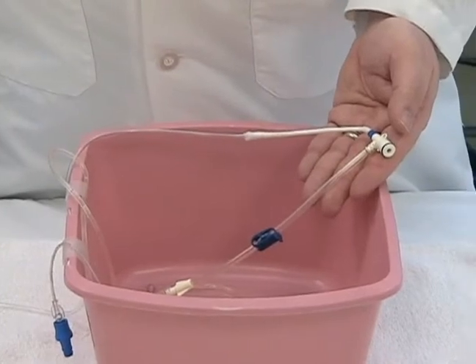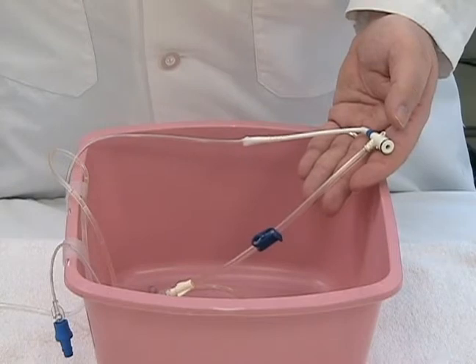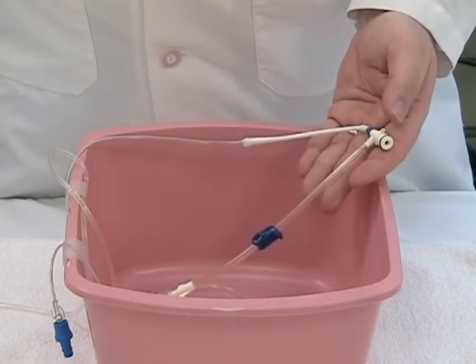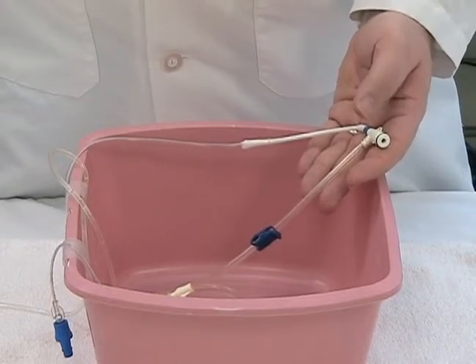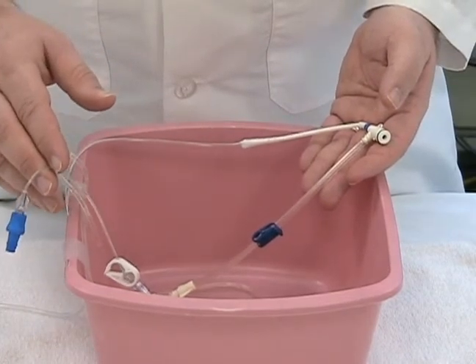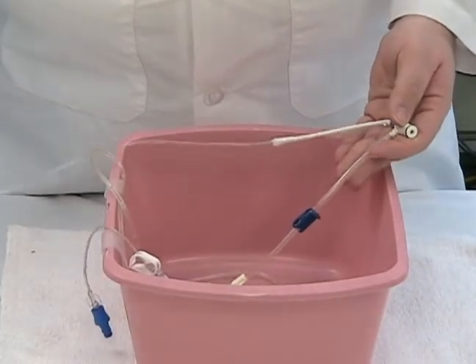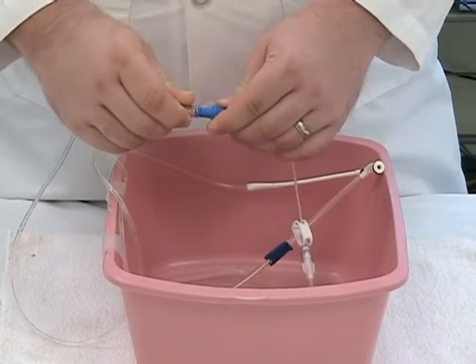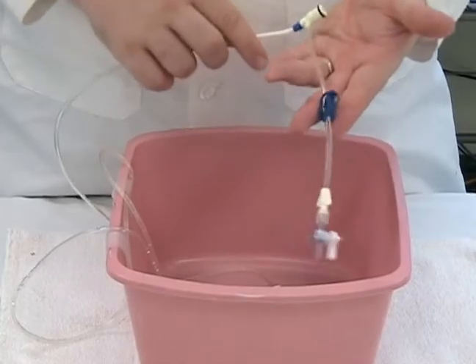This is a cordis line adapter which will attach to your IV fluids drain. Our CTICU nurses asked us to give a simulation of having a central line in the neck of the mannequin that they could push medications and fluids through. We created this adapter, and then it attaches to the extension set, allowing a full circuit that you can push through the neck of the mannequin and have it drain into the basin below. Once the simulation is complete, the fluids that have collected in the drain can then be measured and compared against what the nurses believe that they pushed during the simulation.